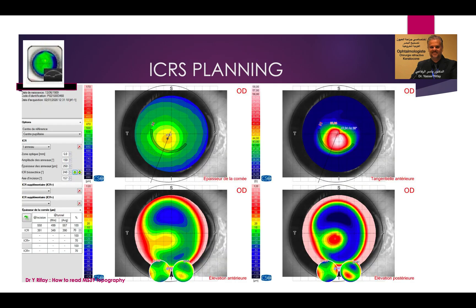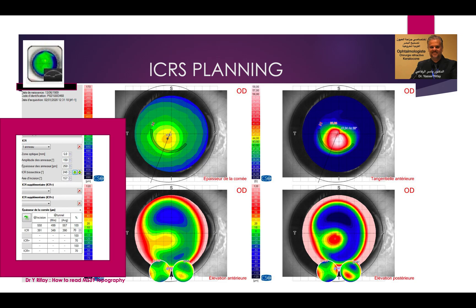There is a model for ICRS planning — intracorneal ring segment implantation. The device will not give you the plan directly, but it will help you. It gives you the axis of the coma. You choose the axis of the coma or the axis of the astigmatism. It provides the safety limits of thickness. The surgeon will then choose the optical zone of the ring and the length of the ring. So the device helps you with these parameters.